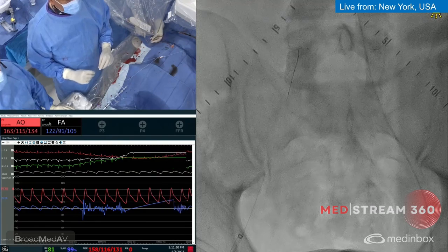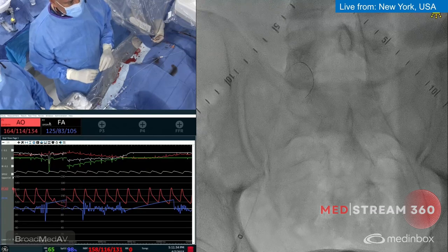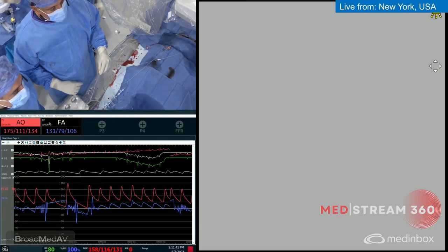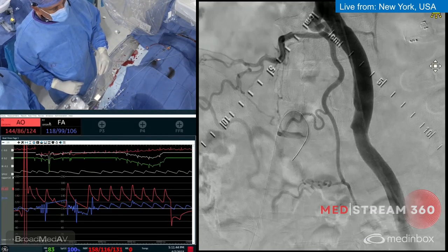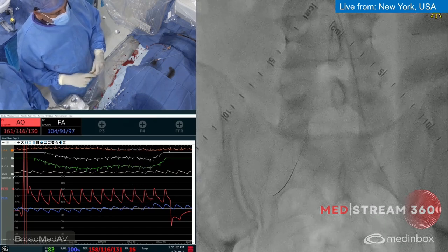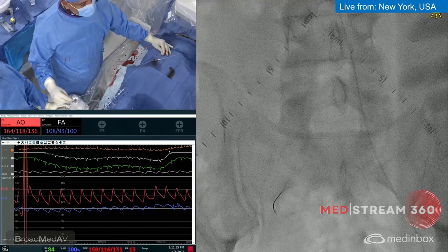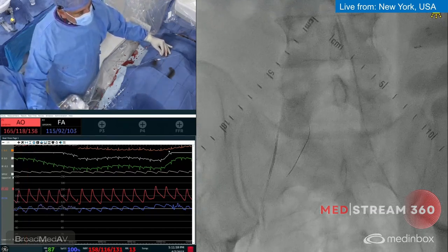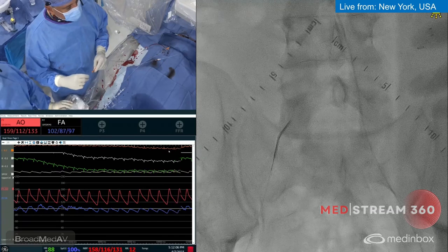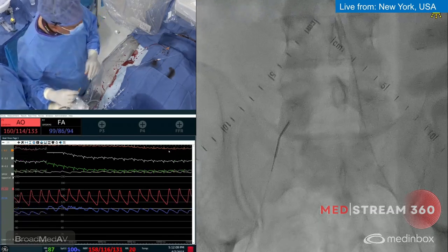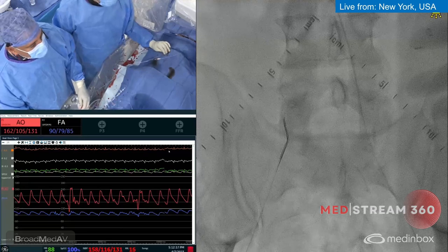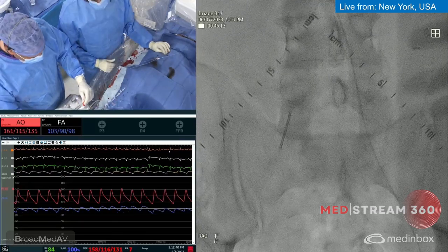All of what we're seeing could be dissection plane. We need to take a picture to figure out our position — if that's the internal iliac, then I know I'm in the true lumen. I can now confirm I'm in the true lumen. Everyone should understand the logic: the stagnation of flow told me where I was. I'm advancing my wire because I know I'm in the internal iliac, confirming true lumen position. Now I'm going to advance the wire, with Vishal assisting from the other side, and confirm flow.